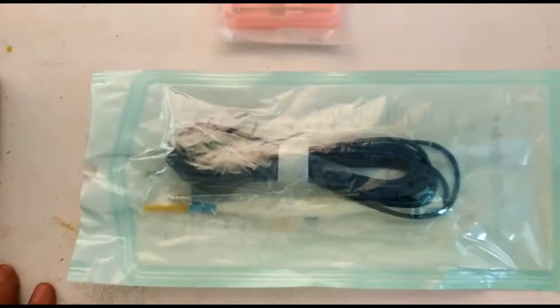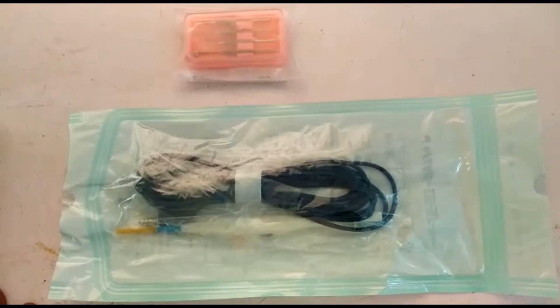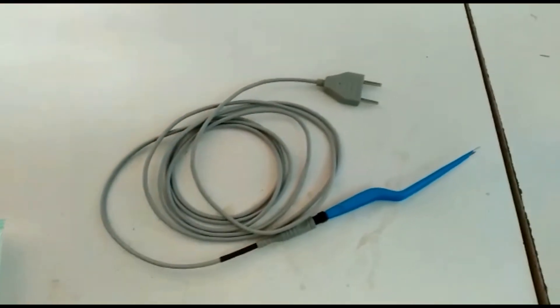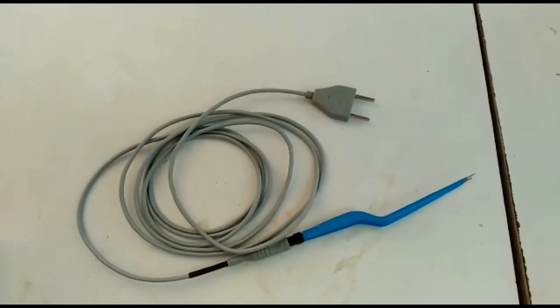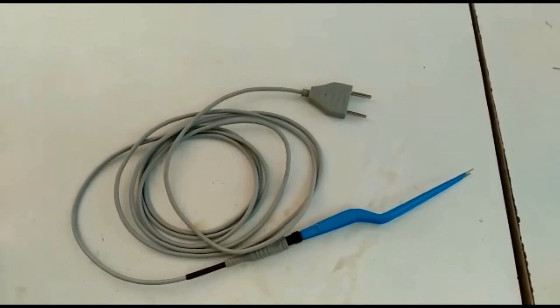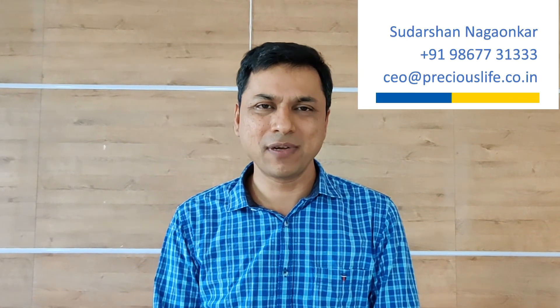This is how the disposable hand pencil looks, with the electrode set on top. Finally, this is the bipolar forceps along with its cable. The two pins on the top go into the bipolar socket on the machine. If you need any support in the future, please feel free to contact me — my contact details are on the screen. I look forward to our association. Thank you very much.